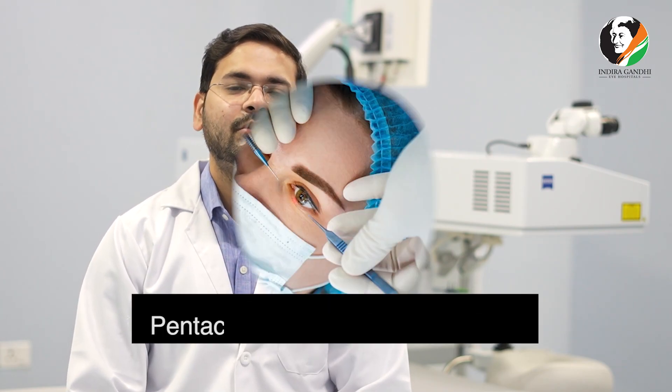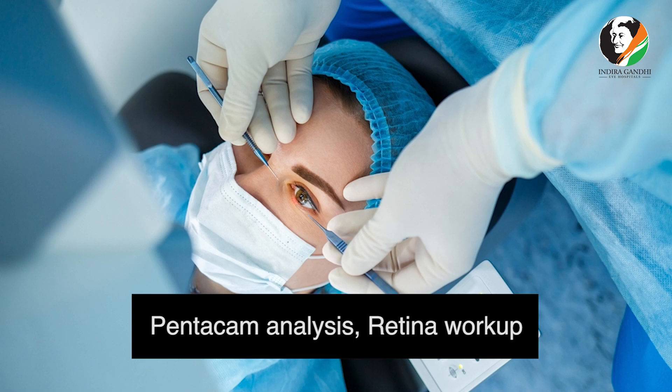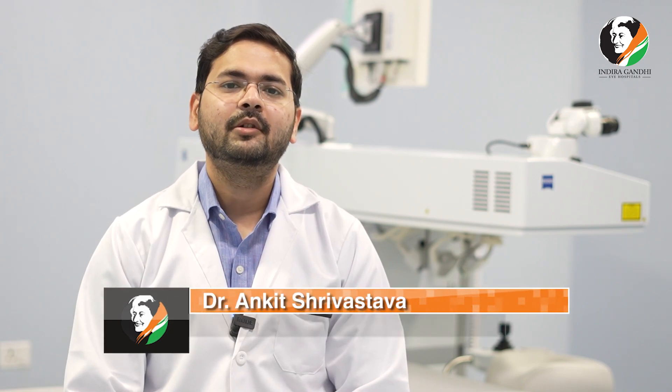For that, the patient has to come for pre-op workup which is done in our OPD. We do the pentacam analysis, retina workup, and the complete refraction so that we can give the best possible result to the patient and also to determine whether the patient is a suitable candidate for LASIK surgery.